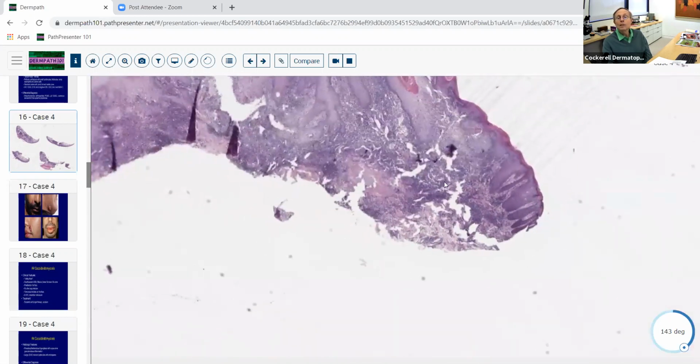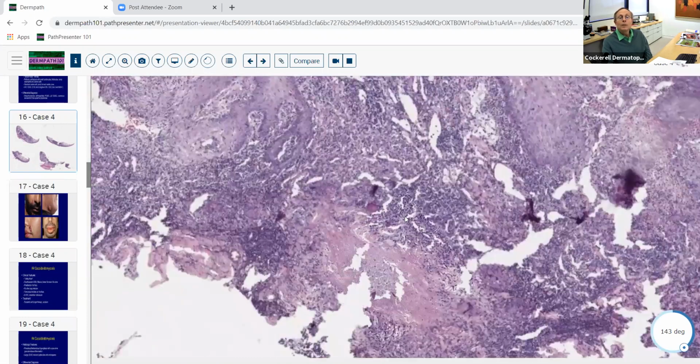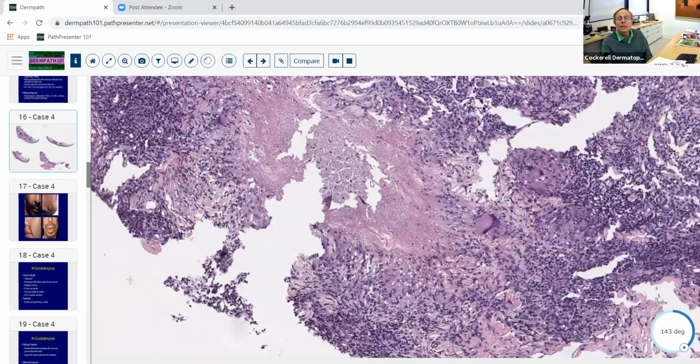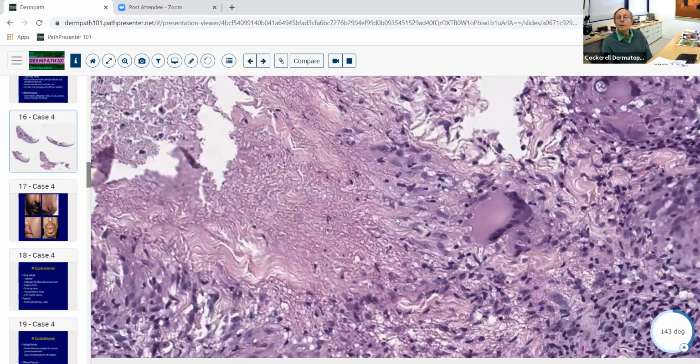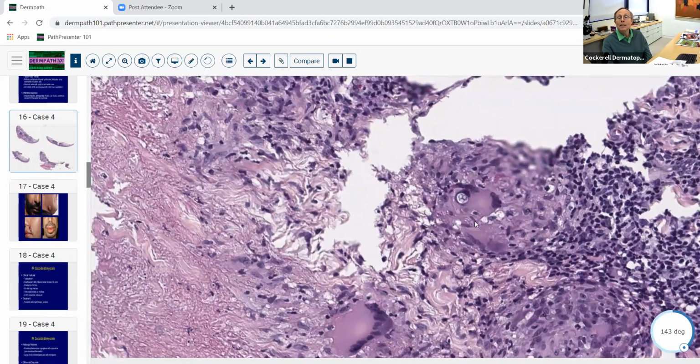This was an example in this case of Coccidioidomycosis. And sometimes you'll see a lot of organisms. Here's an area, there's some degenerated caseation necrosis. Here we go, we got one right here. Look inside the histiocyte. That's a good place to look, is inside the multinucleated histiocyte. So look there, and look in the abscesses, and look in the epidermis where these things get transepidermally eliminated. And we've got a spherule.